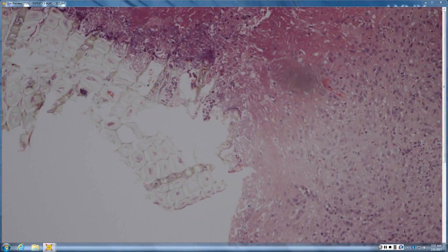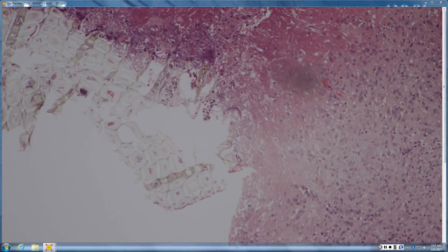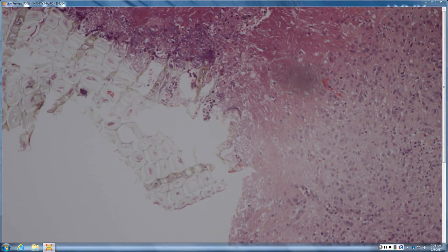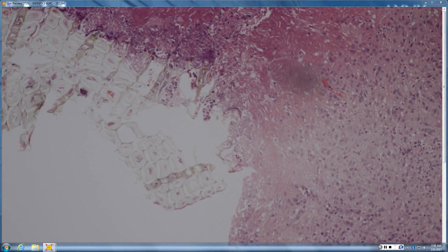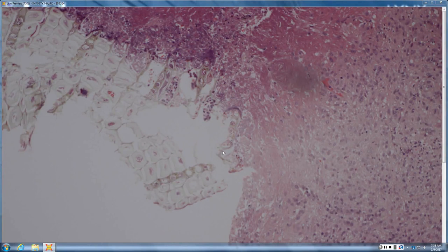So most pheomycotic cysts start with a splinter implantation. And then you get granuloma and you get fungi within the wall. I'm not making out a whole lot of fungi here in the wall. But if we look at the splinter, you can see two types of things with cell walls. You see the wood with its cell walls. And then you see something linear in it that is browner. You know, that's probably a pheo-organism within that splinter. So, you know, always, if you have a giant cell, a pustule, or a piece of wood, those are all good places to look for fungal organisms.